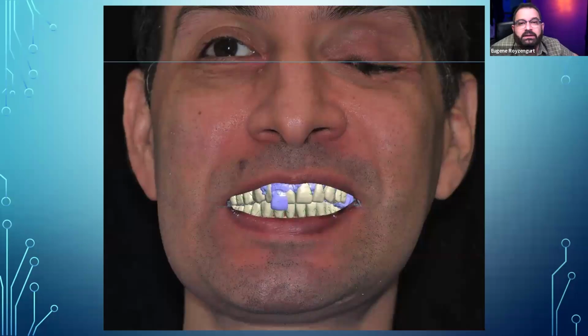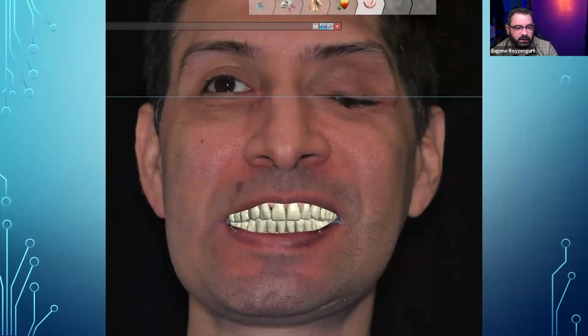Now, it's still not the greatest here, but according to the doctor and me, this is the best possible thing we could do at the time. Now, once it's completed, we can start adjusting things, looking at him intraorally. Once he heals up, should we bring the plane of occlusion up a little bit? Should we close his bite a little bit because he's showing a lot of lowers here at the time? So things like this can be done moving forward, okay?